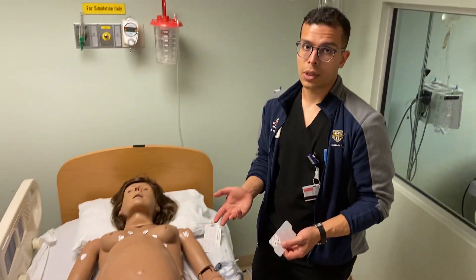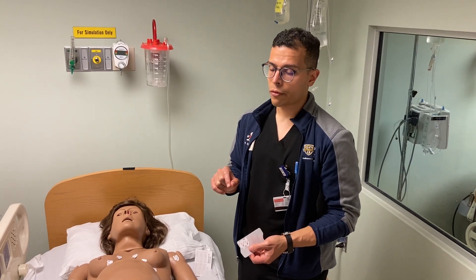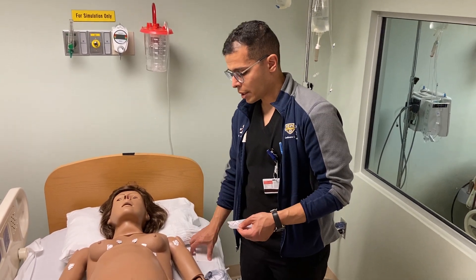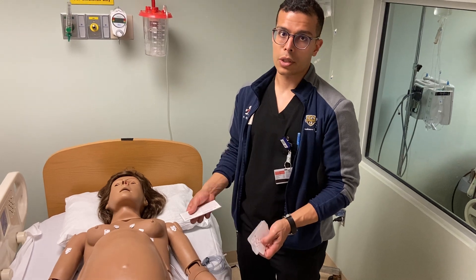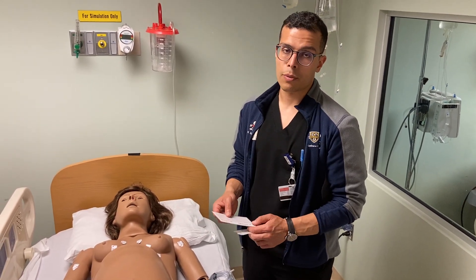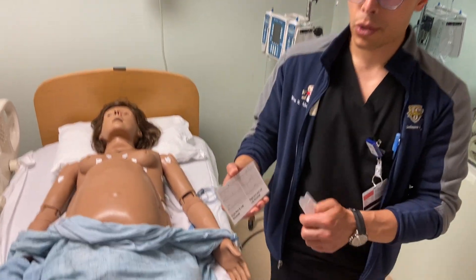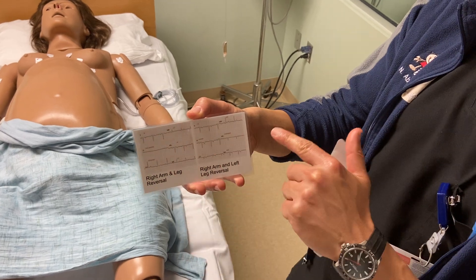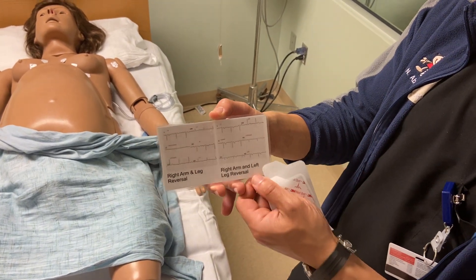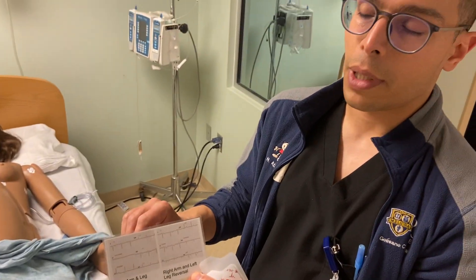Remember to always put the medical record number in with the E in the beginning. If the patient is not able to sit still and it's not an urgent EKG, you can wait two minutes just to minimize artifact on the EKG before you record it. Anytime you see a flat line — an isoelectric line — that means there is limb lead reversal. So double check your lead placement and the lead connection at the cable junction box.